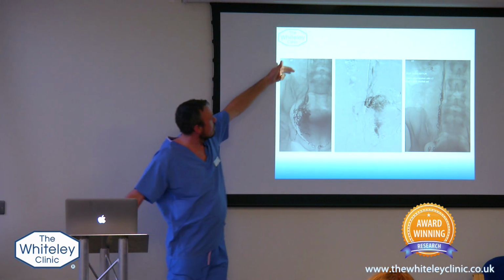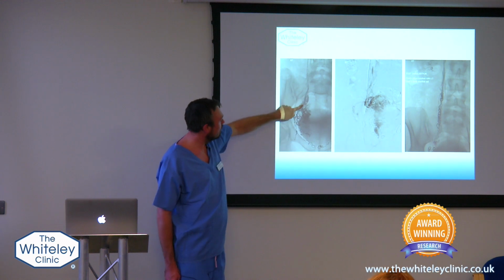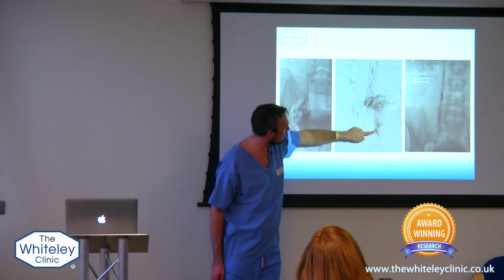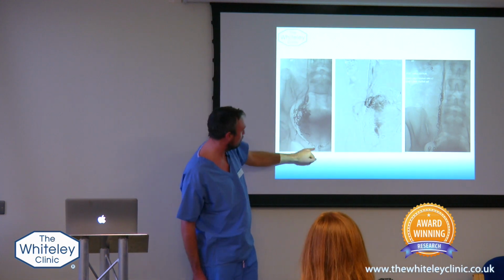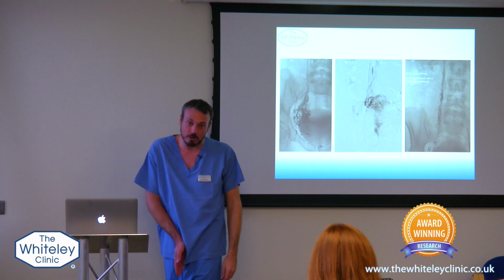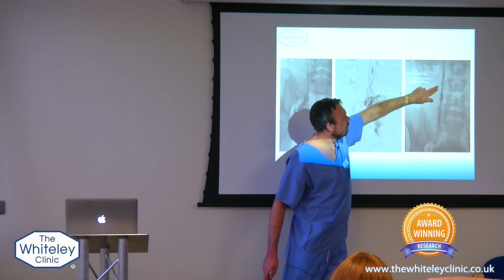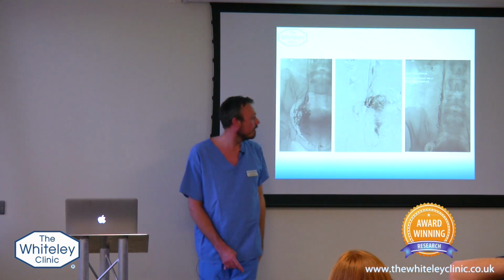So now this pattern here, this is an ovarian vein. And if you follow the contrast, you can see it's coming down and actually across this pubic bone here. So that's spilling out from the ovarian vein onto the vulval area. And that's the coil then going upwards in the ovarian vein.